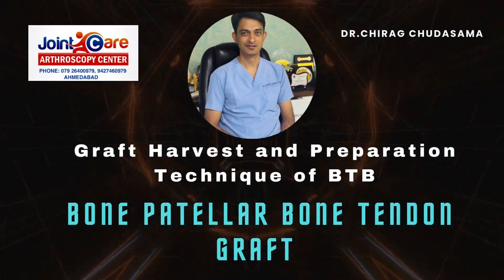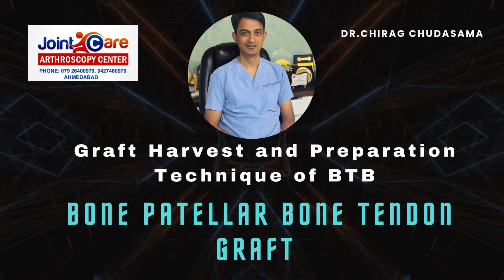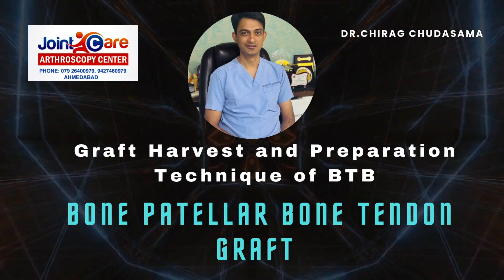Hello friends, I am Dr. Chirak Churasama. Today I will be demonstrating bone patellar tendon bone graft harvest technique. This graft is very useful in various ligamentous procedures.